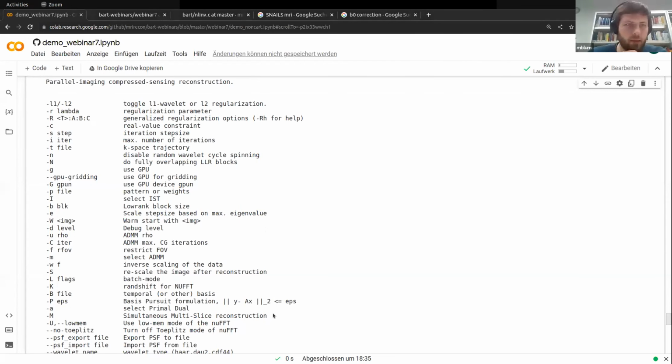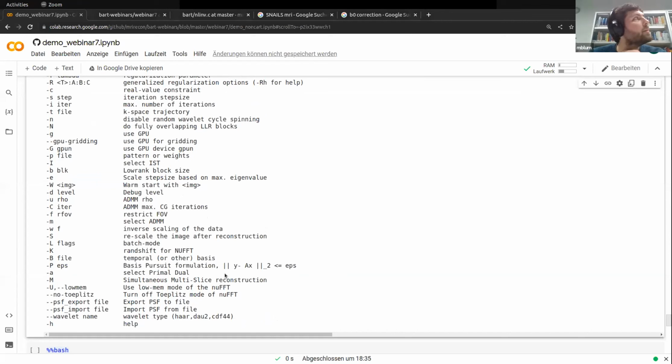So there is, I just take again the share screen. If we, or maybe it's not that important. I must say I'm not sure.